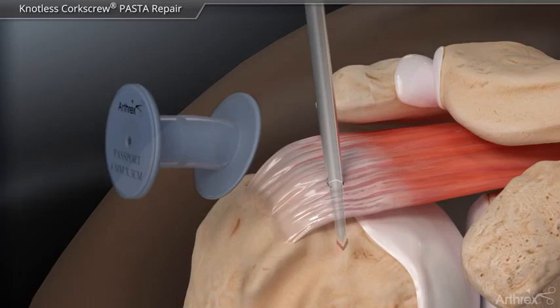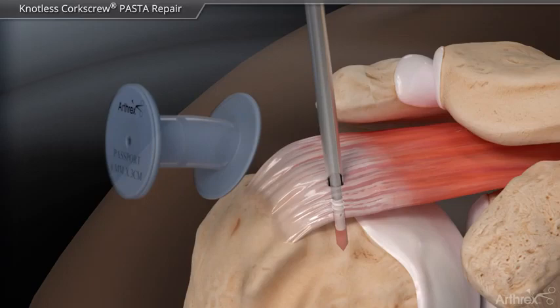The knotless corkscrew anchor is inserted by pushing the anchor into the bone socket until the thread touches the bone. Then the anchor is threaded into the bone.